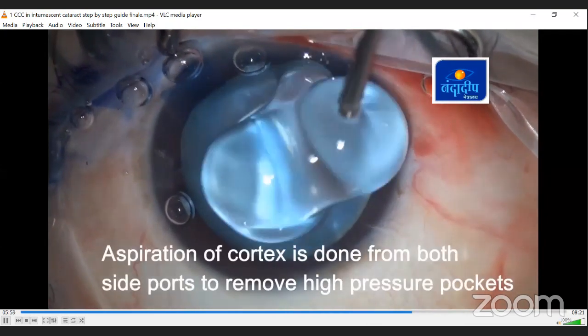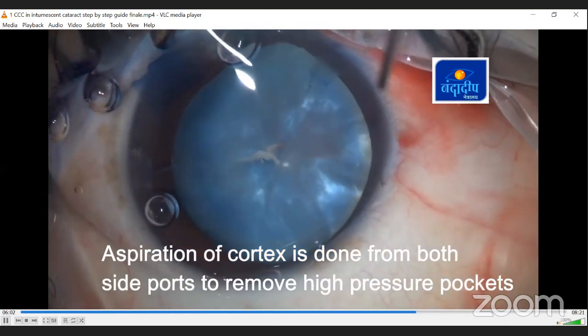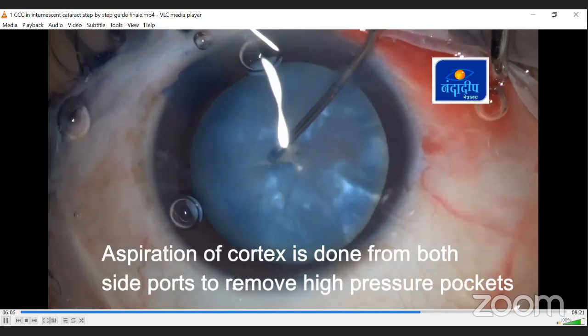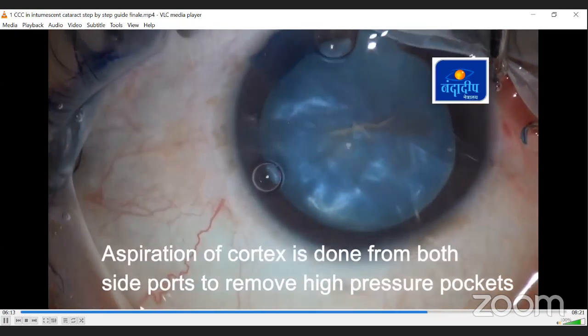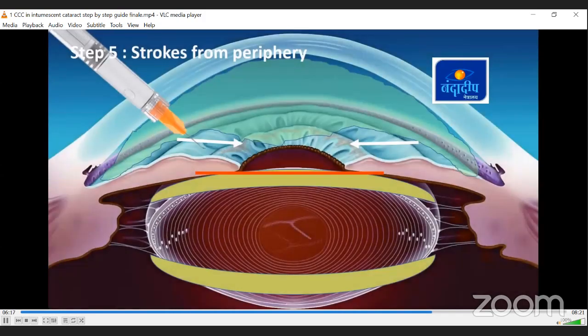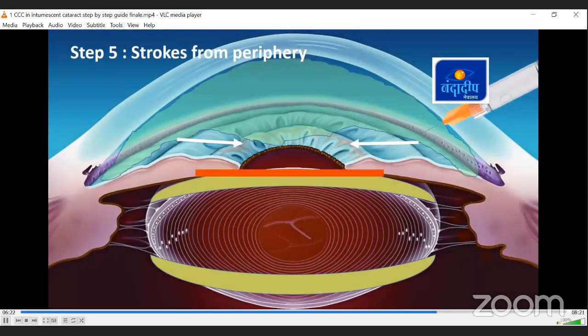And you always do it from both sides so that the liquid cortex which is trapped gets cleared from both sides of the tear. Otherwise, you start the rhexis from one side and you end up tearing on the other side. So always do it on both sides. And this is a very important step.